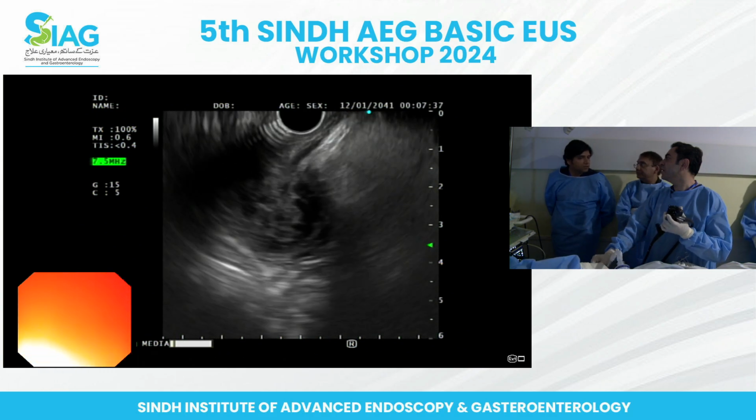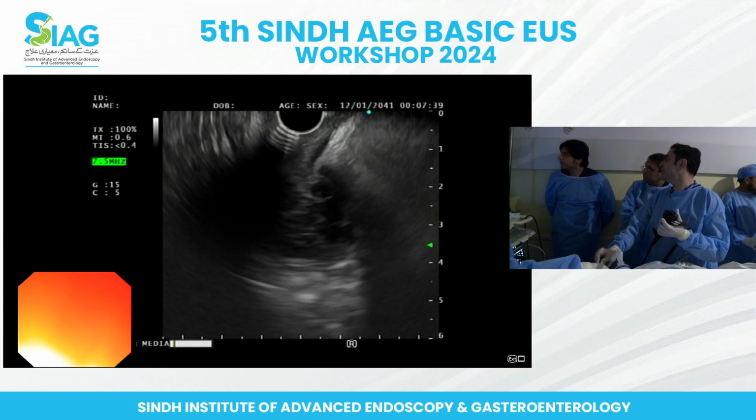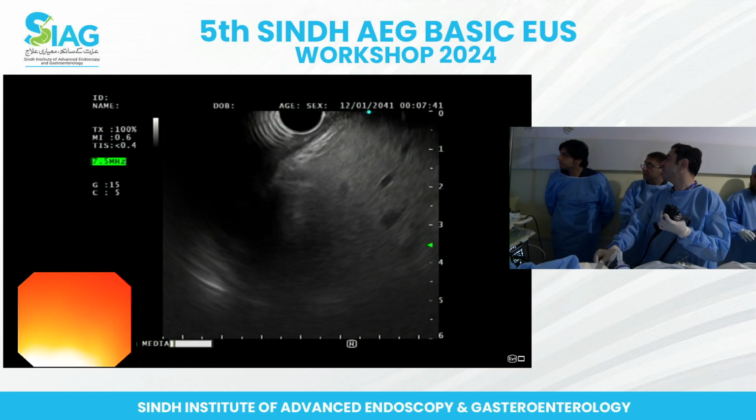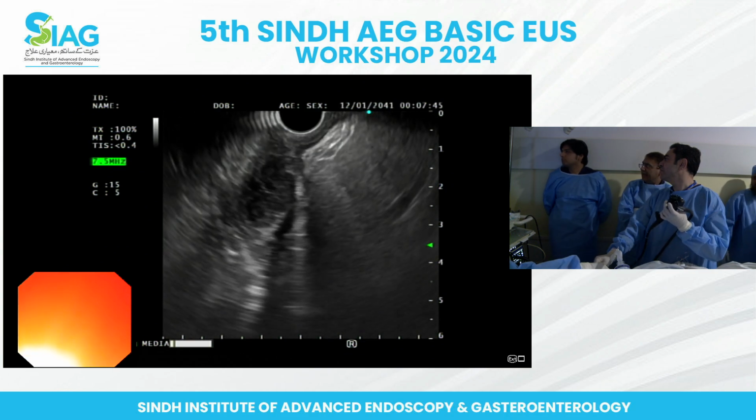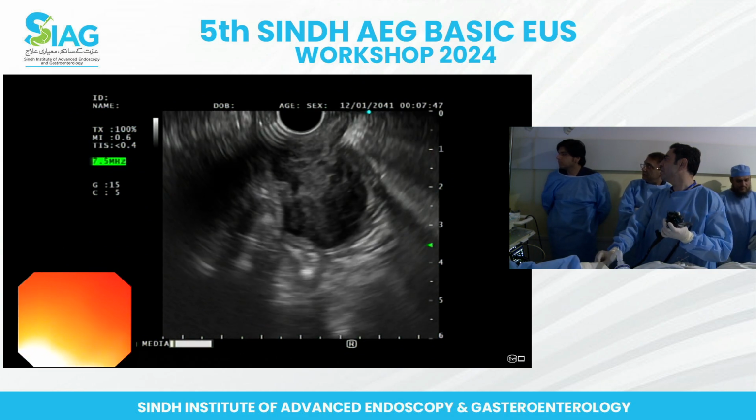Yeah, because that would give us a real idea whether it's attached to the wall.